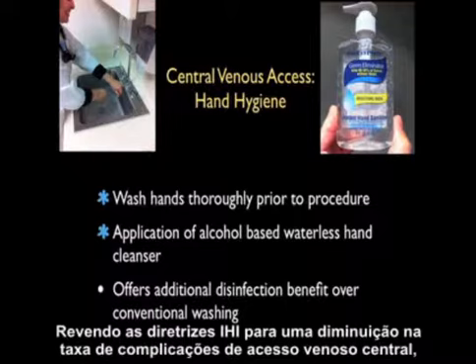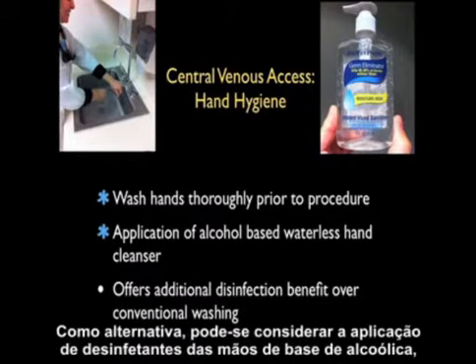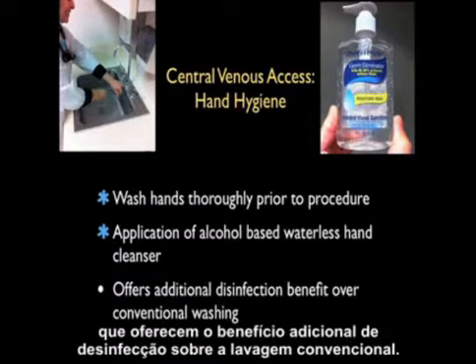Going through the IHI guidelines for decreasing the complication rate for central venous access, the first step is to wash your hands thoroughly prior to the procedure. As an alternative, one can consider application of alcohol-based waterless hand cleansers, which offer additional disinfection benefit over conventional washing.